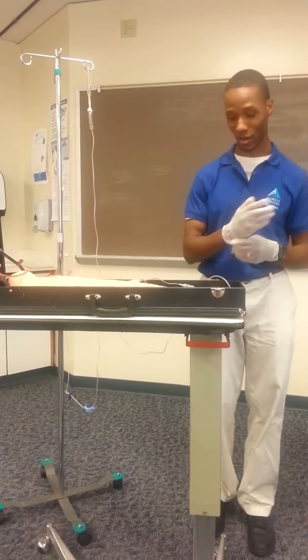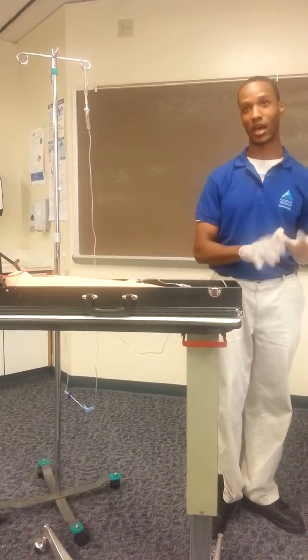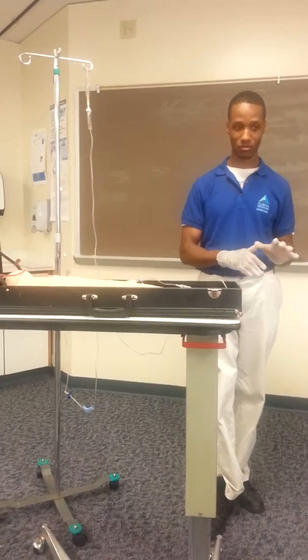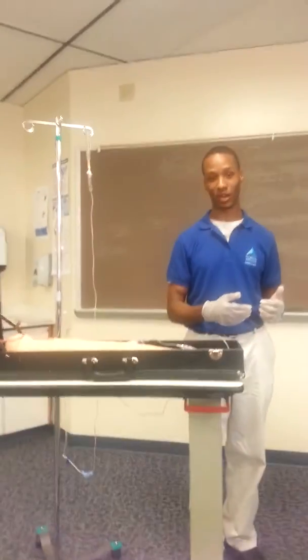I would then take off my gloves. I would chart on the MAR the time the medication was started, the amount, how the patient handled the procedure, the amount of IV fluid, and the condition of the IV site.